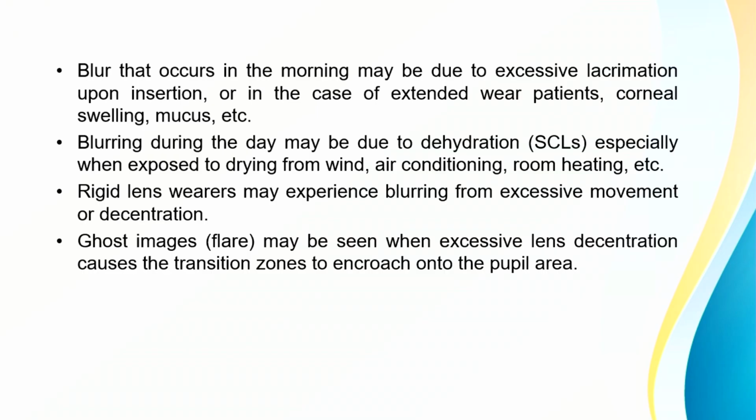Other than that, if the patient is complaining of any dryness or blurry vision, that can be due to the environmental factors where they are sitting, maybe in an AC environment or a very windy area where their contact lens gets dried up, because of which they can end up with blurry vision. Third thing, if the patient is not following the cleaning properly, then the deposits will get etched into the contact lenses, which can create blurry vision. So assessment of the contact lens is important when the patient is telling you about ghosty vision.